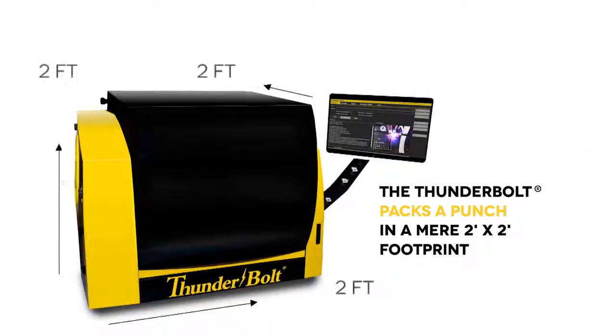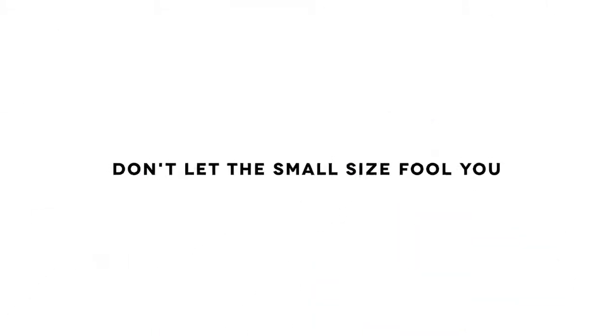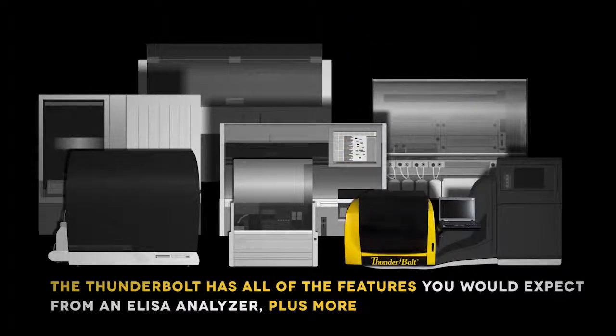The Thunderbolt packs a punch in a mere 2x2 footprint, the smallest and lightest instrument in its class. But don't let the small size fool you — the Thunderbolt has all of the features you would expect from an ELISA analyzer, plus more.